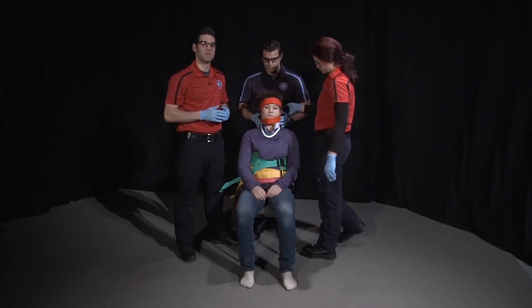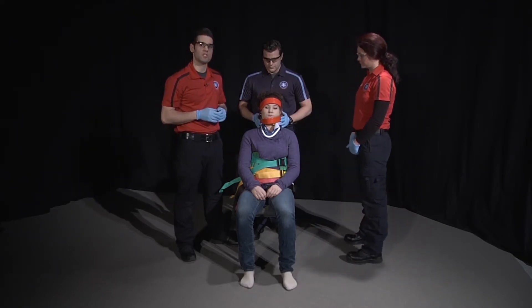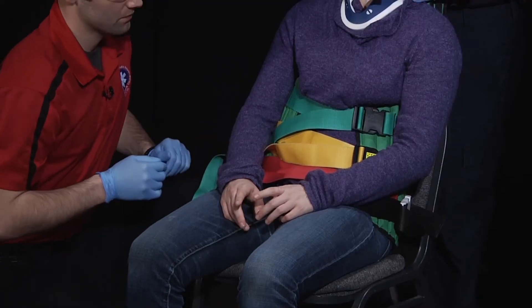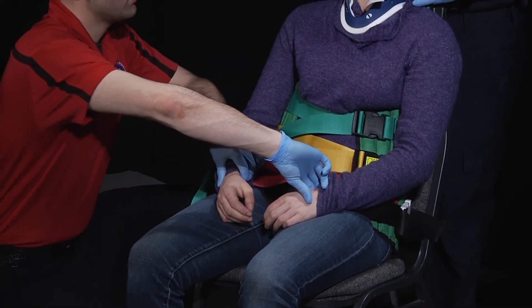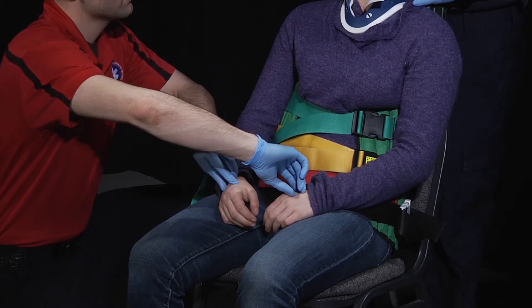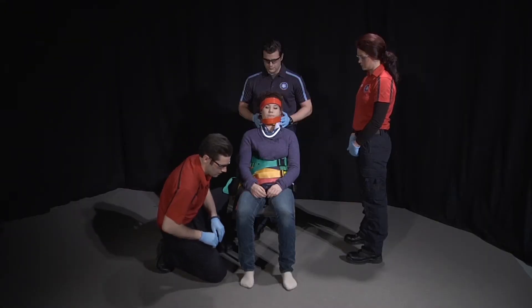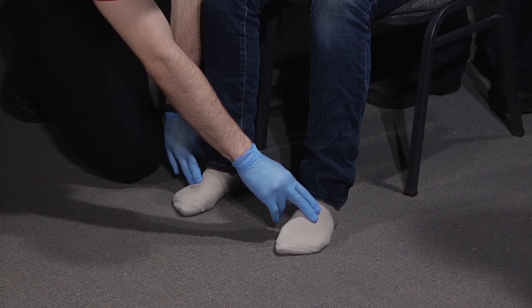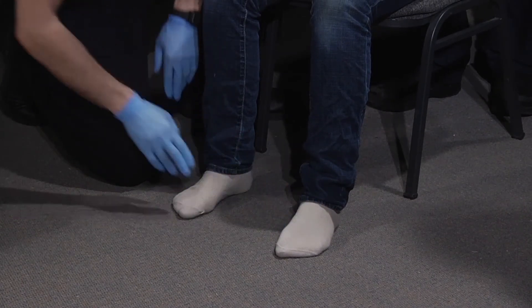Once the patient has been secured to the device, we will reassess motor, sensory, and circulatory functions in all four extremities. Are you able to move your fingers? Yes. Checking radial pulses. Are you able to feel this? Yes. Are you able to move your toes? Yes. Checking pedal pulses. Are you able to feel this? Yes.